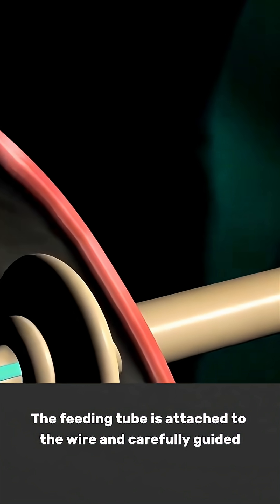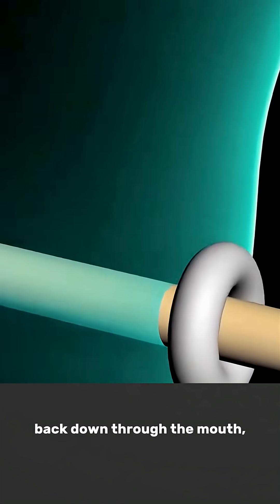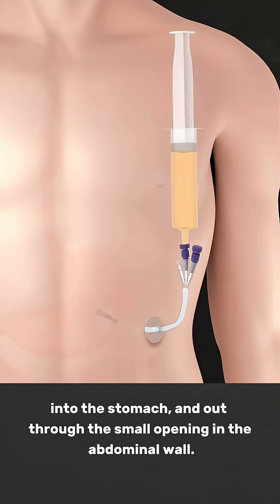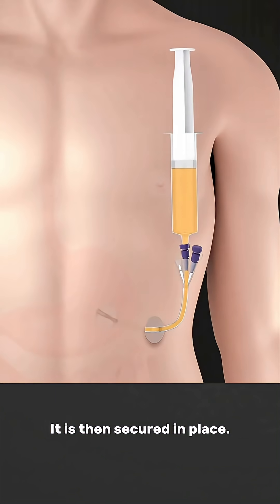The feeding tube is attached to the wire and carefully guided back down through the mouth, into the stomach, and out through the small opening in the abdominal wall. It is then secured in place.